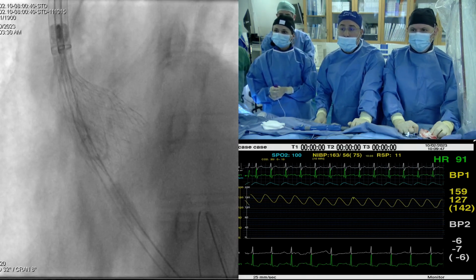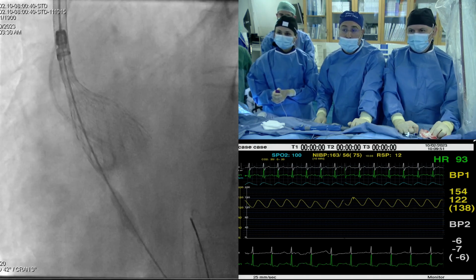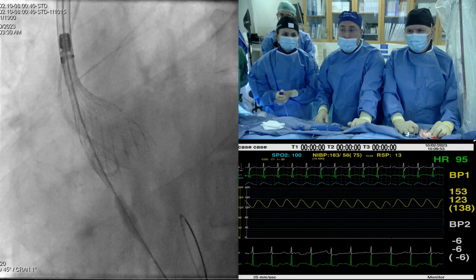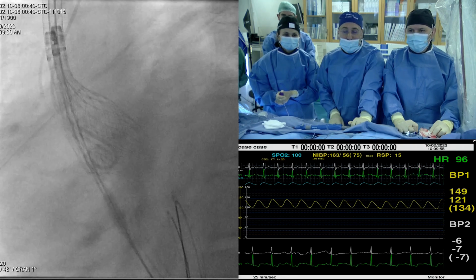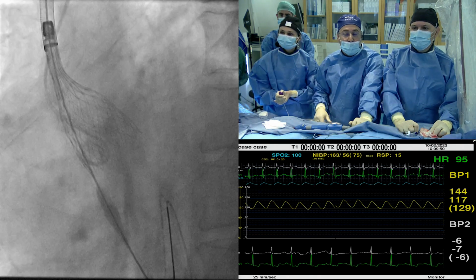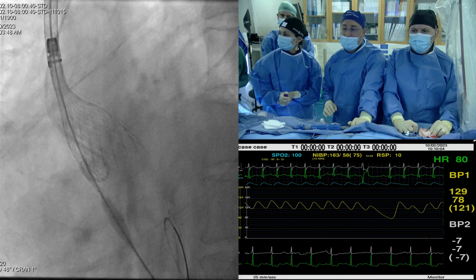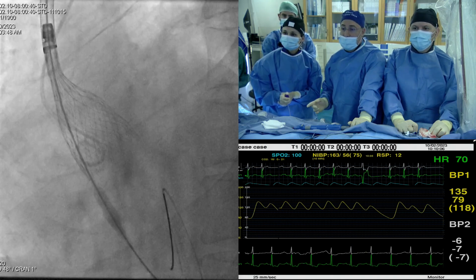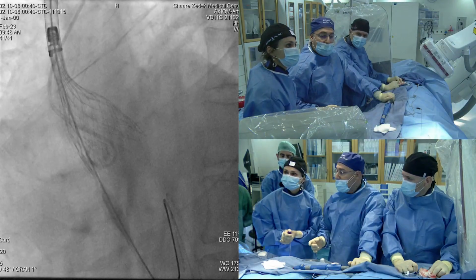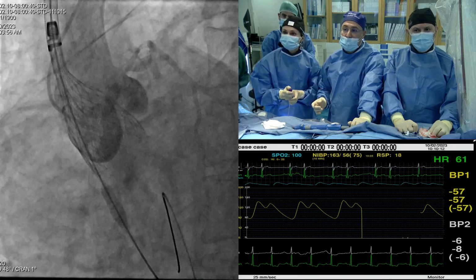It's interesting, Chaim, how this is how Jean-Claude taught us how to do TAVI, and you taught us. You are one of the most famous proctors, right, Chaim, of Evolut. It was always LAO, and now we are implanting in different projections, playing between them all, adding information in each one. Yes. Ready? Ready. Beautiful.